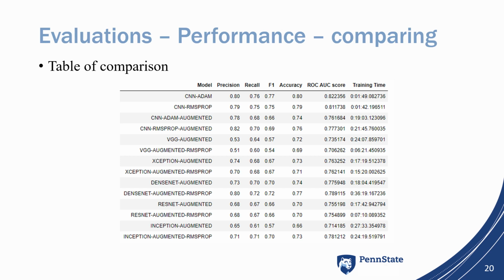And in terms of comparison between ADAM and RMSprop, we can see variations between the results. Sometimes ADAM yields better F1 and accuracy score. Sometimes RMSprop outshines ADAM. Sometimes they both give the same results. So we conclude that both optimizers perform the same for our data.